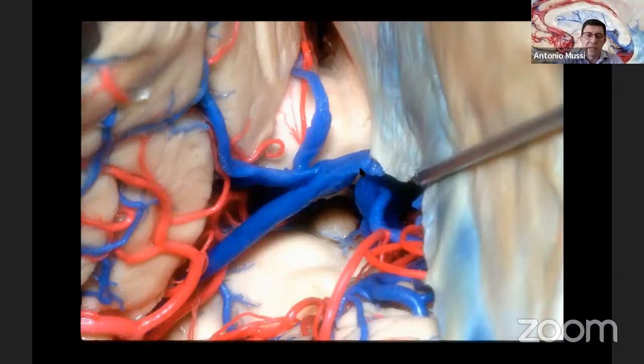Another advantage comparing with the infratentorial approaches is that you have a much better view above the vein of Galen. You can dissect the posterior part of the interhemispheric fissure. You can even access the contralateral side by doing an incision above the straight sinus on the falx and look to the other side. This is a precentral vein, basal vein of Rosenthal. This is the vein coming from the medial side of the brain. This is the posterior part of the corpus callosum.